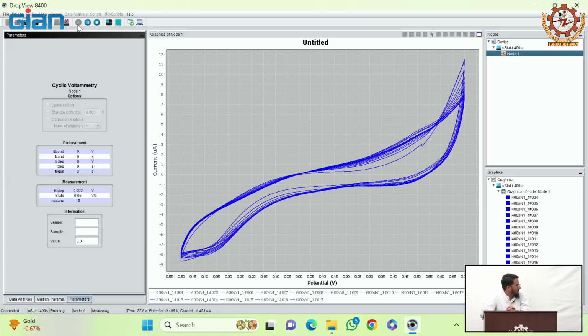So, if you wish, 15 scans is something which we have seen works well. If you want to make the sensor stronger, or if you want to ensure that the electropolymerization is done properly, then you can go for higher number of scans as well. Okay. So, in the interest of time we have kept it 15, but if you wish we can go up to 20, 25 as well.